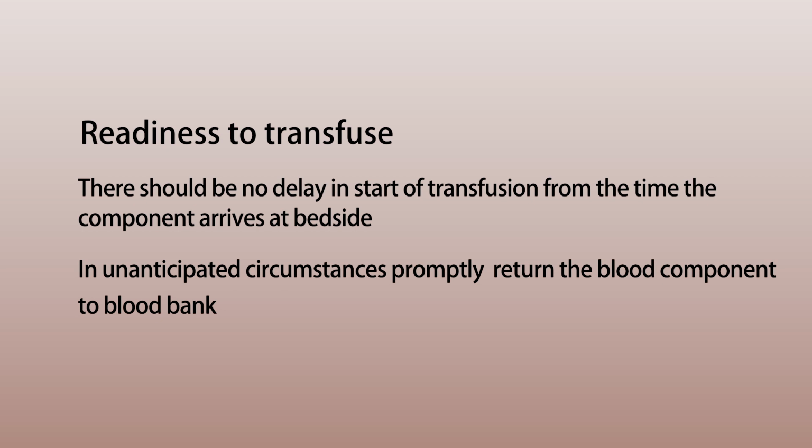It's very important. The golden rule of 4 hours out of the refrigerator should always be practiced for all the blood products, especially the ones which are stored in a refrigerator like RBC. And these 4 hours includes the time for transfusion. That means to say, from the time the blood is removed out of the refrigerator, within 4 hours the transfusion should be completed.